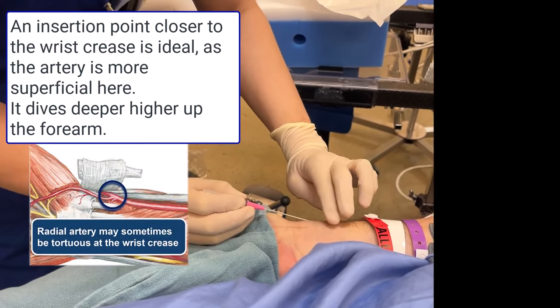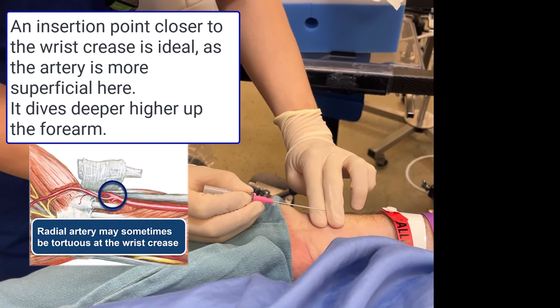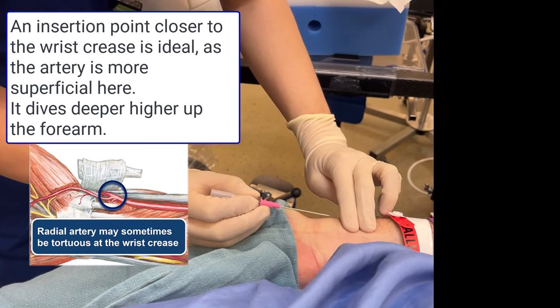However, the radial artery can also be tortuous close to the wrist crease, so ensure that you also palpate and identify a straight segment to enter.